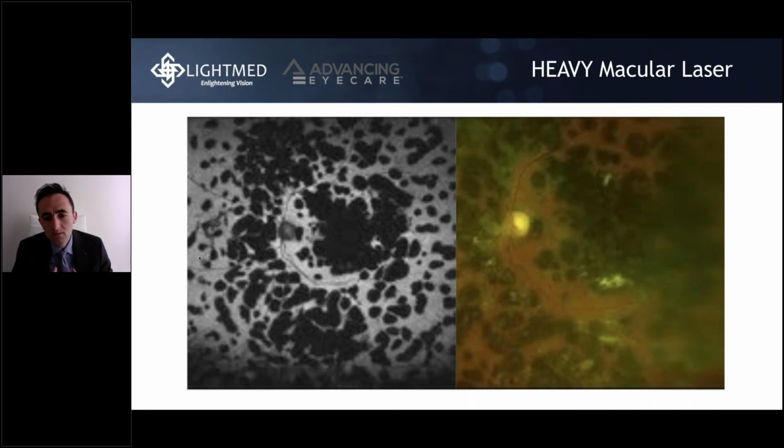because different patients' retinas are different. So laser is kind of an art. You have to find the perfect balance for treating this specific patient, because different patients have different retinal thickening or different capabilities of absorbing the laser in the tissue. For example, if you have a lightly pigmented patient, you might need more power for the laser to take, whereas if you have a darkly pigmented patient, you need less power for the laser to take.